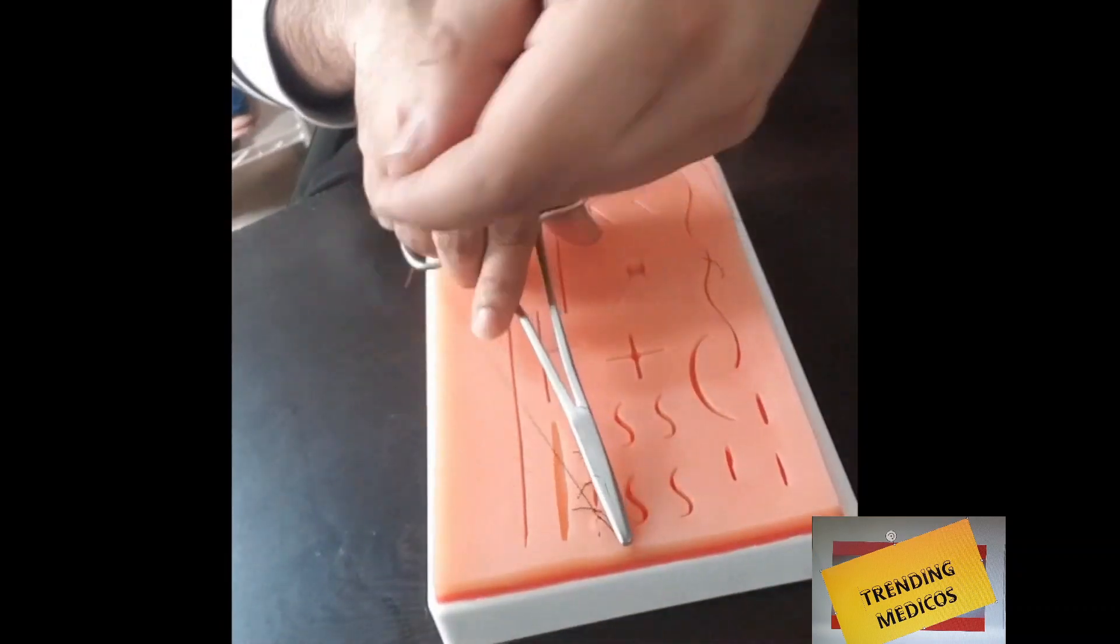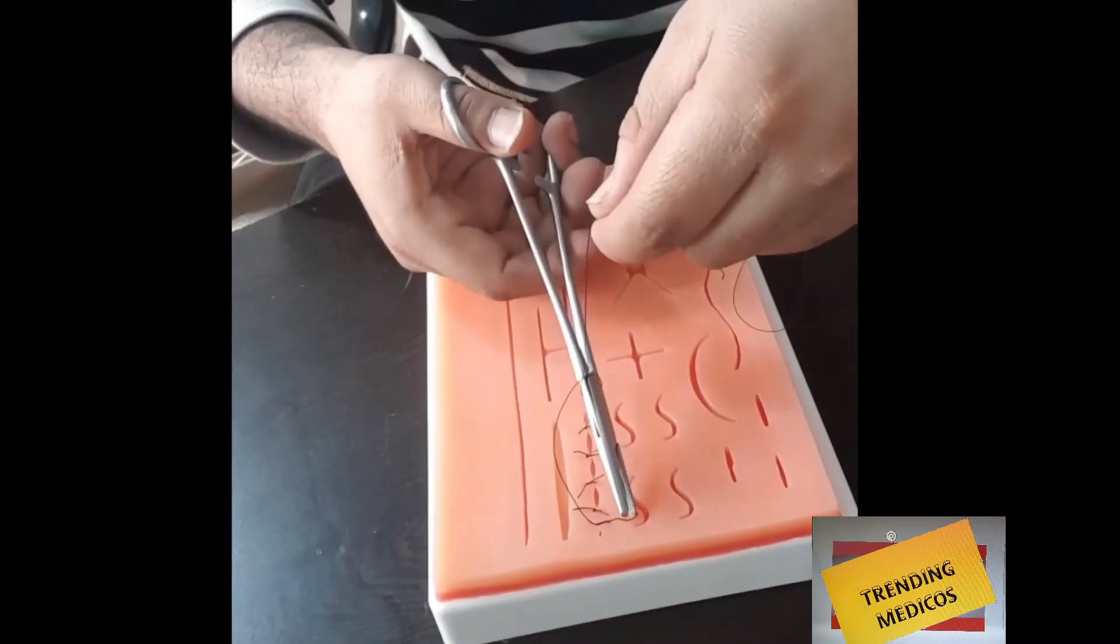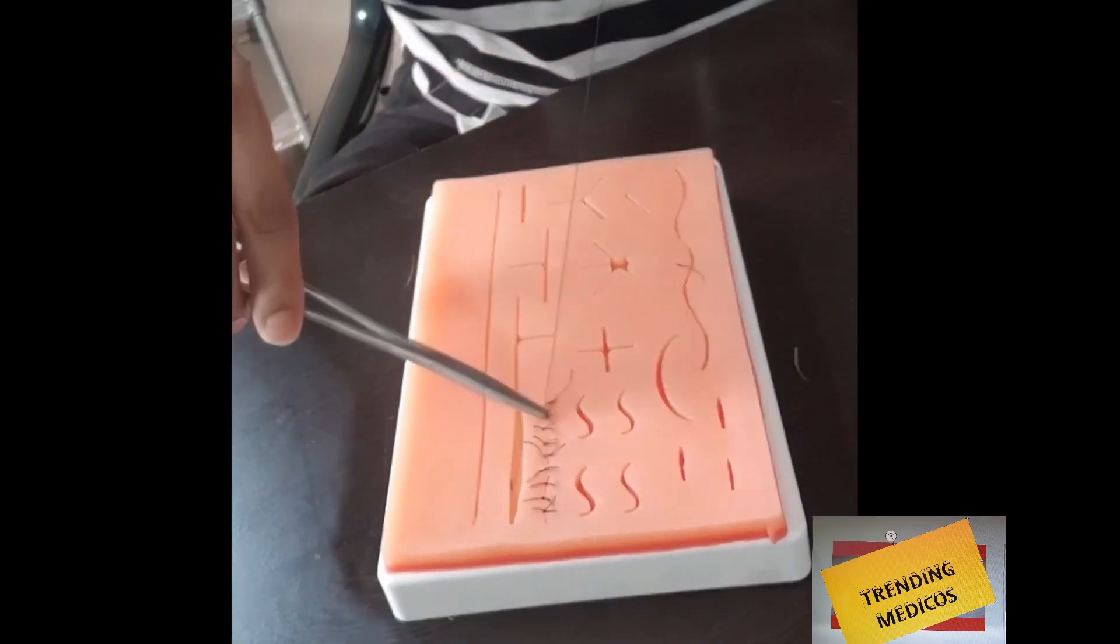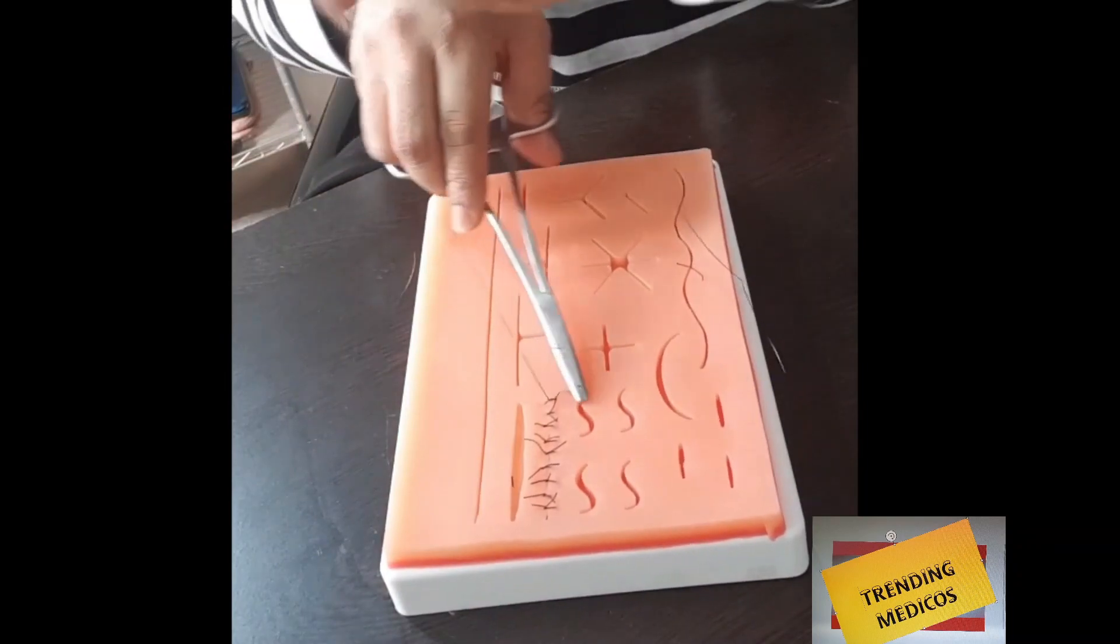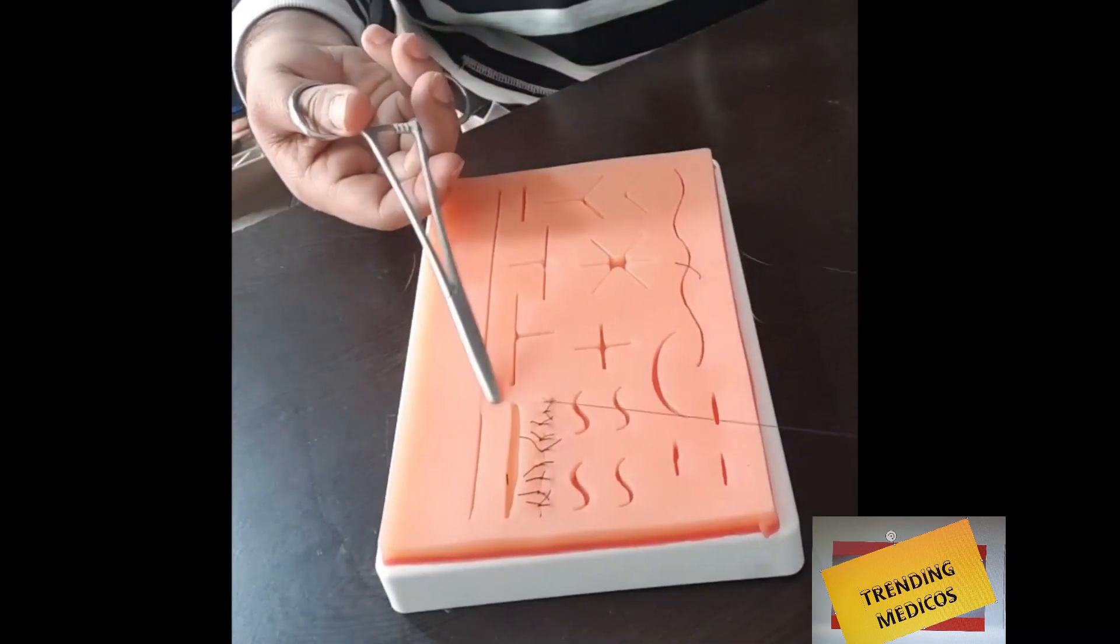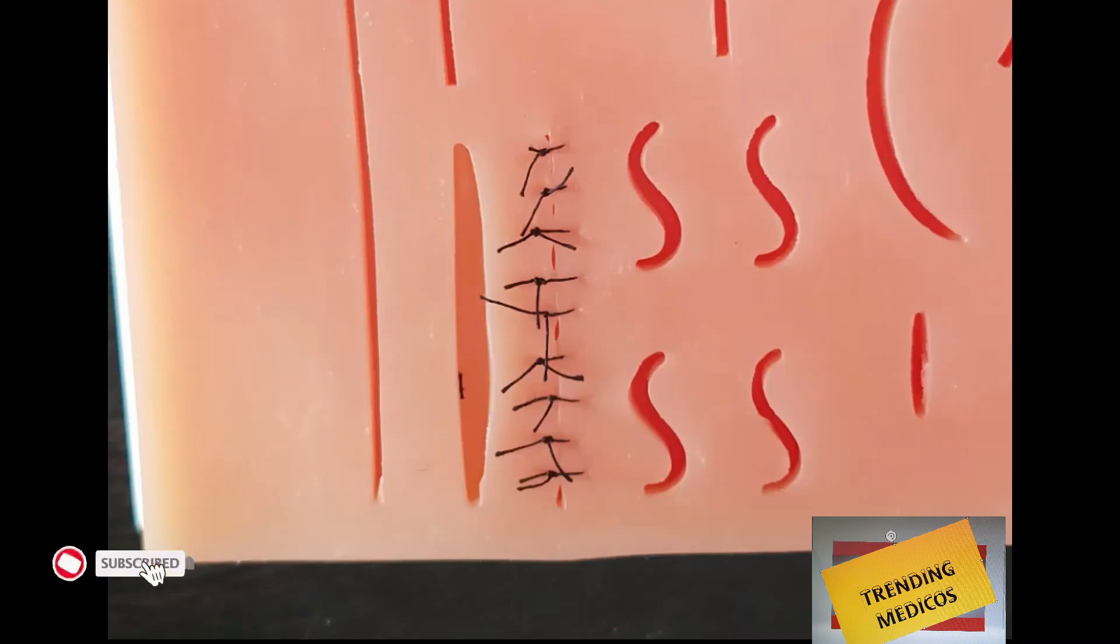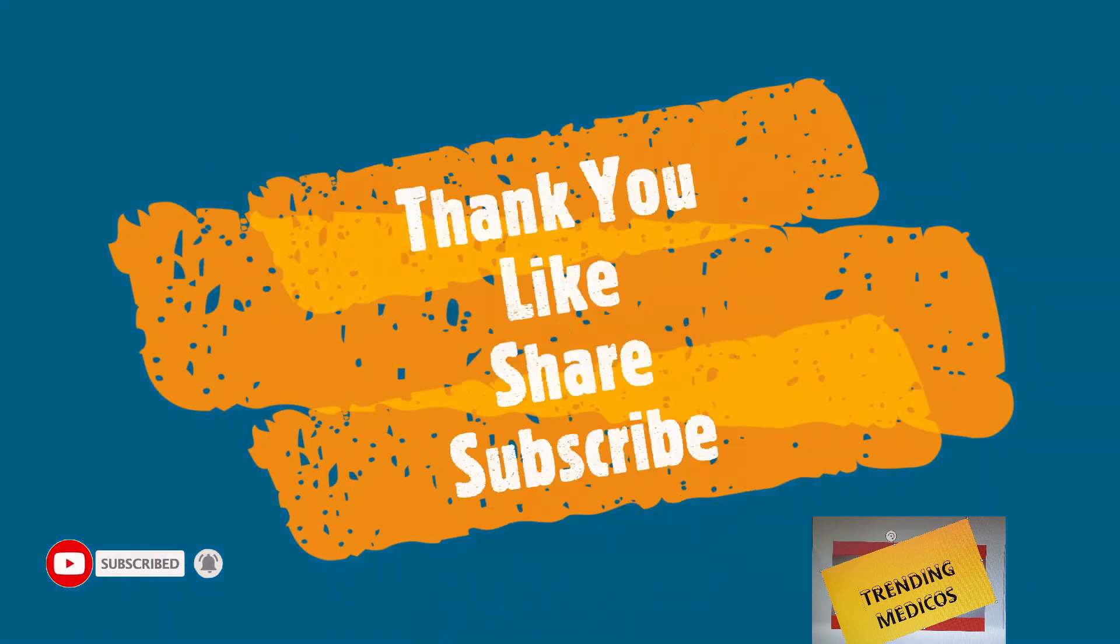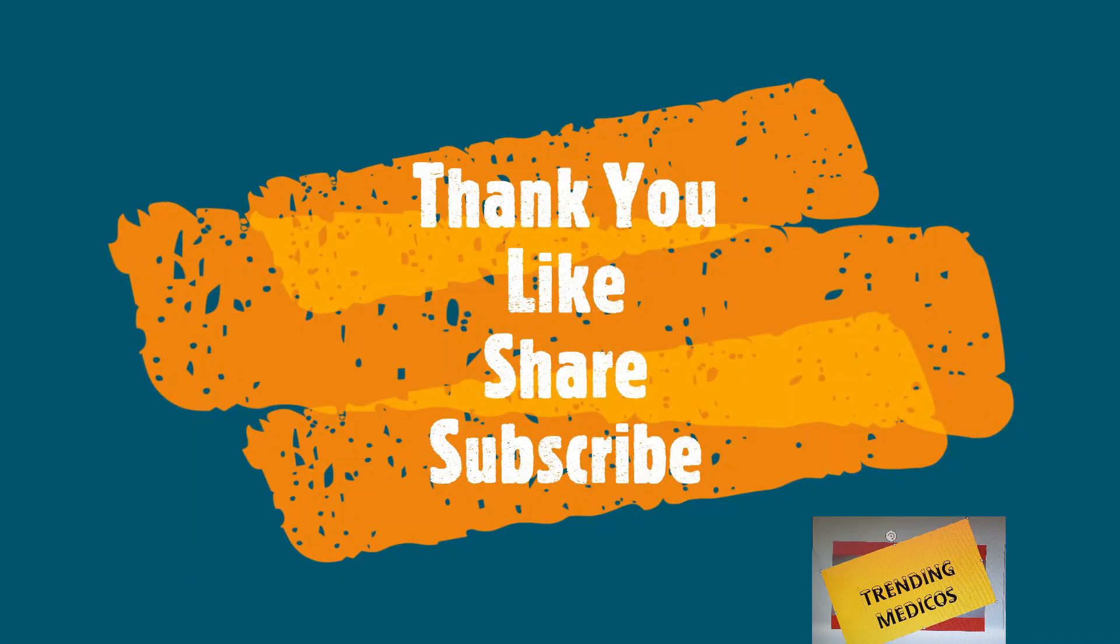This is the final suture being taken, and this is the final look of the suture pad. Thank you so much. Next time we'll learn about continuous sutures, so wait for the video.